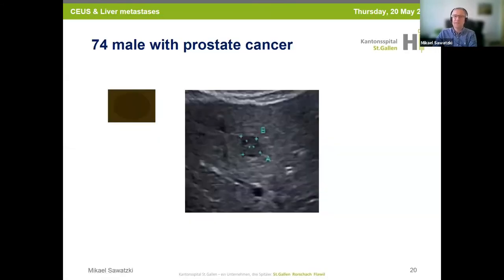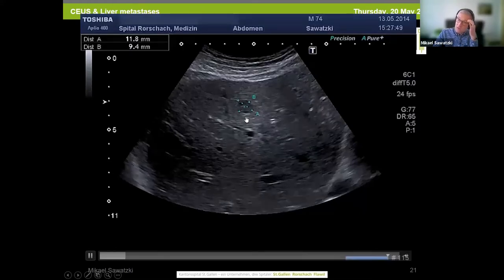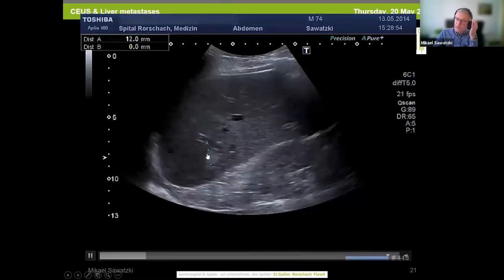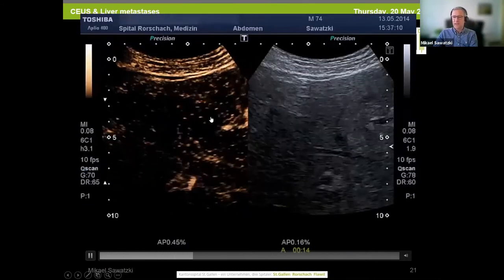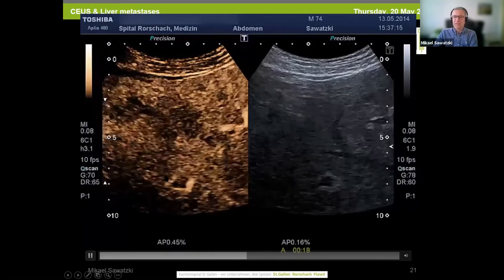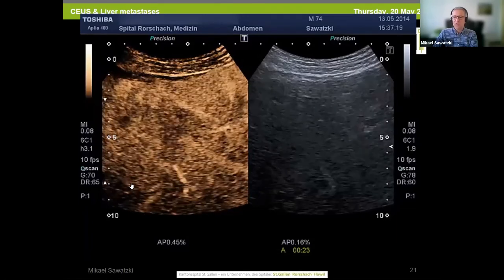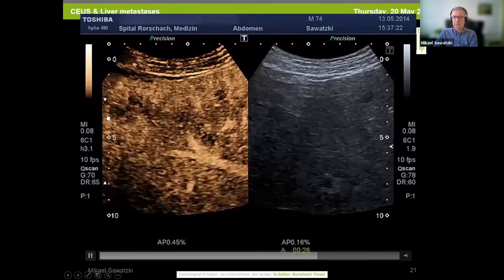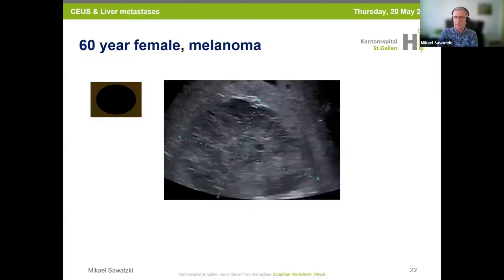This is the example of a 74-year-old male patient with prostate cancer — an example of a hypo- or iso-enhanced liver metastasis. You see a hypoechogenic liver lesion of 12 mm, and also other hypoechogenic lesions — three lesions in the liver. In the arterial phase, there is no hyper-enhancement of this lesion, but you will recognize multiple washout lesions: the whole liver has liver metastases here, here, here, and here. Wash-in, wash-out — it's very simple.